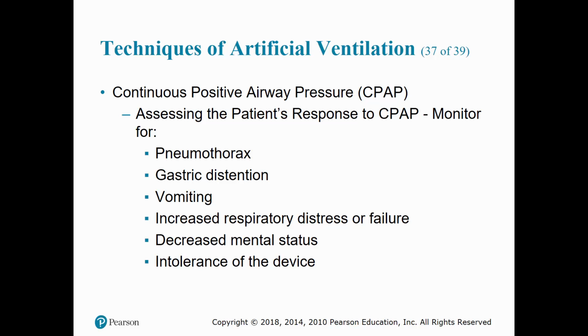Also, if any of these conditions occur, such as gastric distension, pneumothorax, or decreased mental status, it would be necessary to discontinue CPAP and select an alternative treatment.